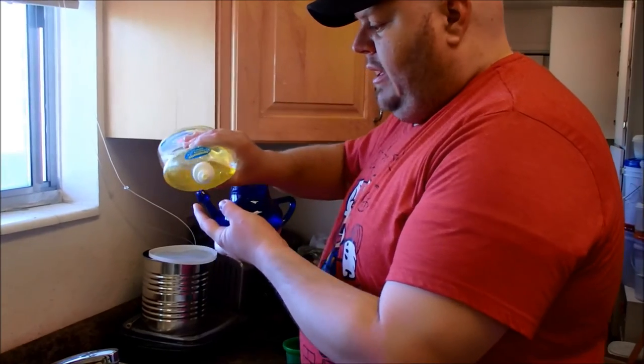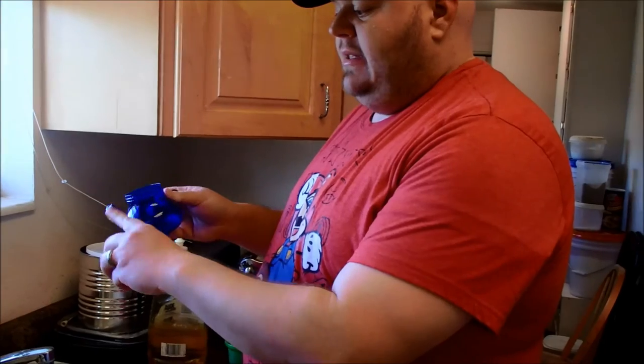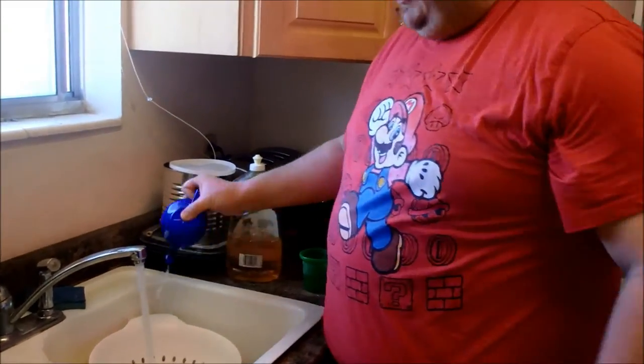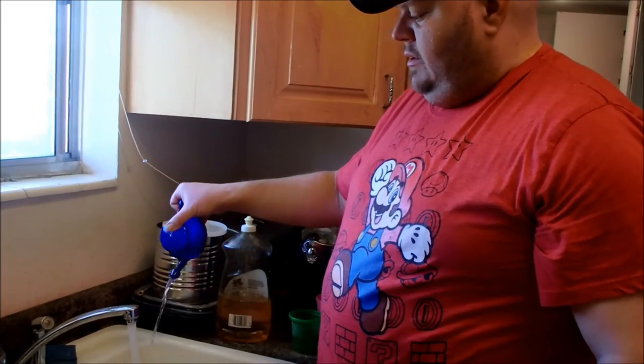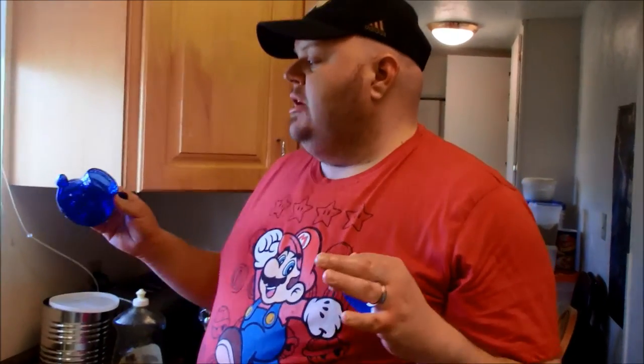Now we're going to clean and rinse our neti pot. Get the water warming up so it's plenty hot, put a little bit of soap in there, get soap on your finger to clean the tip — make sure that gets sanitized and disinfected. Fill it up, put the lid on, shake it, squirt it out to rinse the tip. Again, you don't want to share your neti pot with anyone because it has been up in your nose with gross stuff coming out all over it — you can spread germs that way. One person, one pot, don't share.